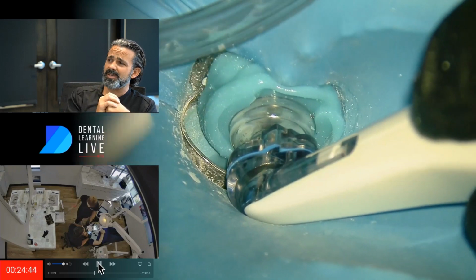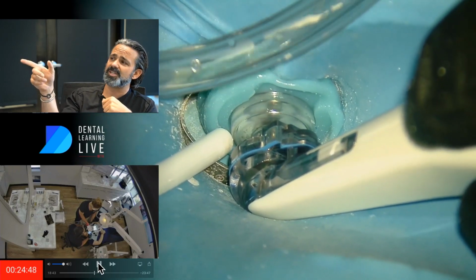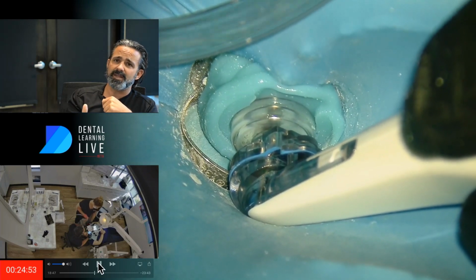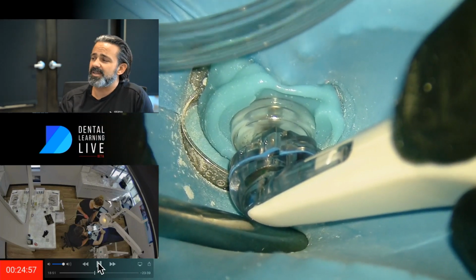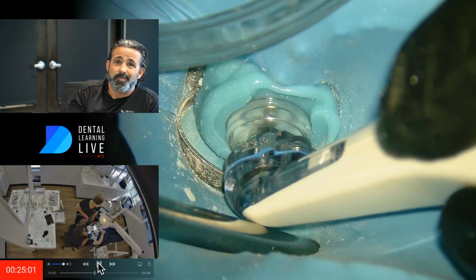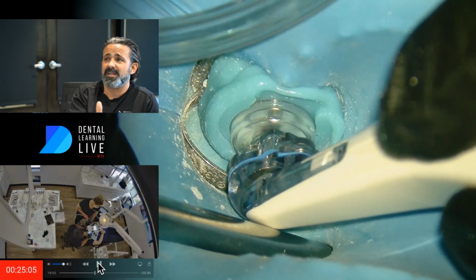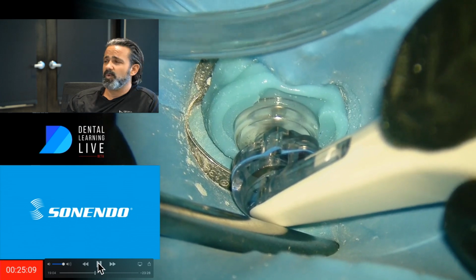Now, my patient does have limited opening, and as I'm positioning this, you'll see the head of this procedural instrument kind of lean up against that rubber dam, and I'm kind of just jockeying it down into place. And what I'm doing is I'm using the mirror handle to kind of help me push it down there where I'm not pushing into the back of the mouth, but I can get it down the long axis of the tooth. And from there, I can get a really nice seal.